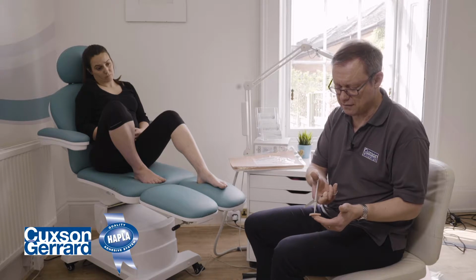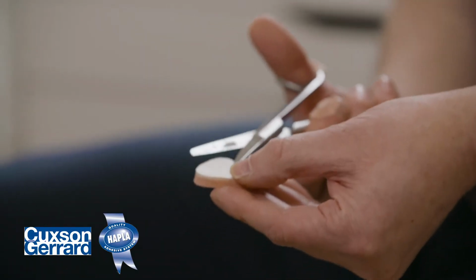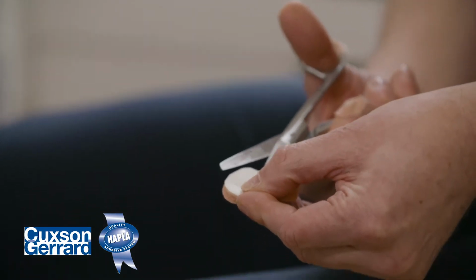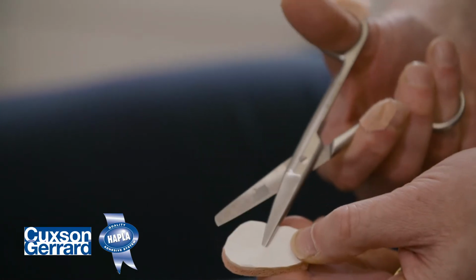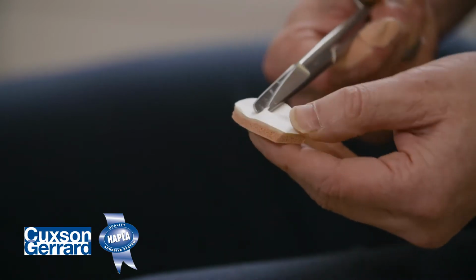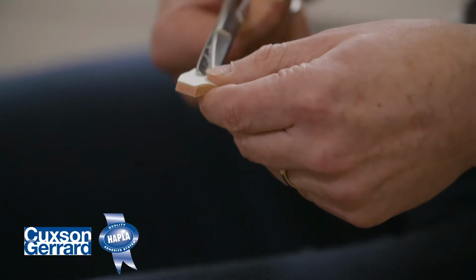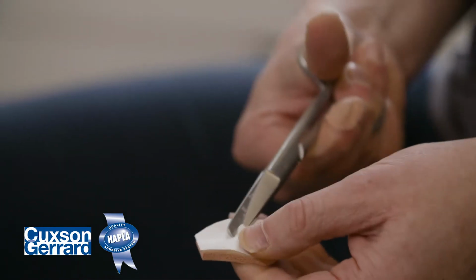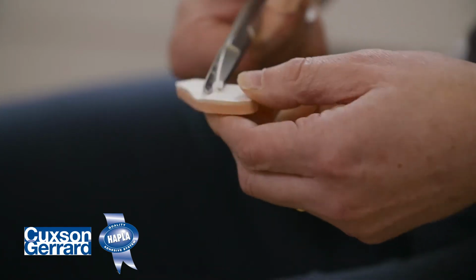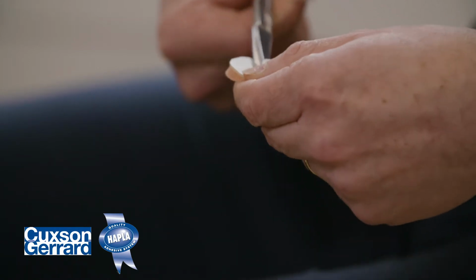But as soon as you've pierced into the felt, just a fraction with the point of your scissor, then immediately lay down parallel to the paper surface and insert just a small way the point of your scissor. As soon as you've done that, start to cut. Start to make a light aperture in the paper and in the felt portion of this foamer felt. This small hole will serve as a pilot hole, so you know that you're approximately in the correct area.